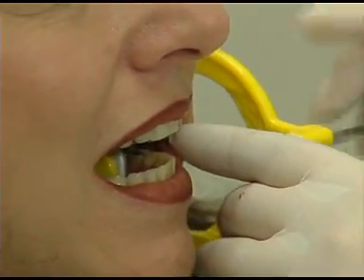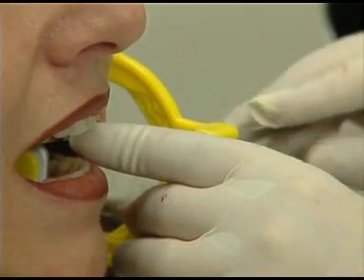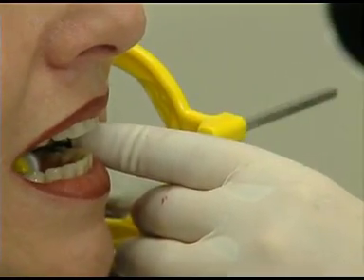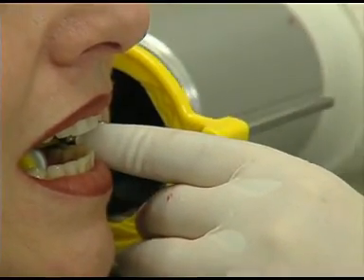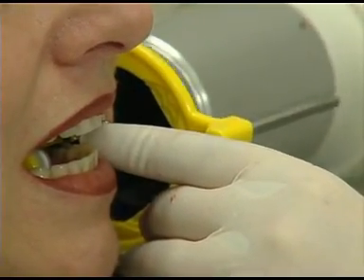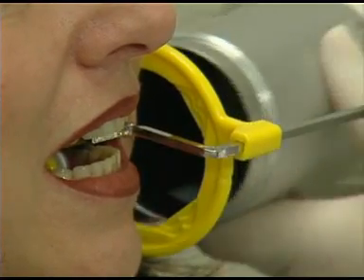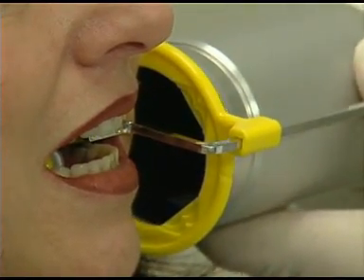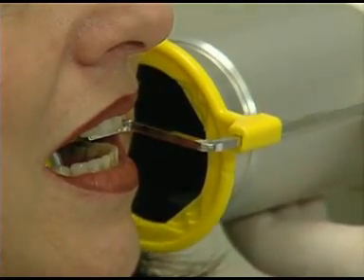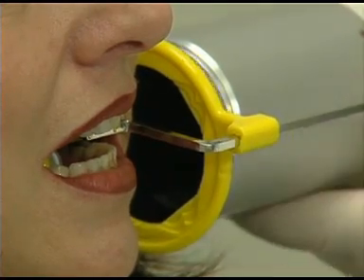With the instrument and film in place, instruct the patient to close the mouth slowly but firmly. Slide the localizing ring down the indicator rod to the patient's skin surface. Position the localizing ring and PID, and then expose the film.